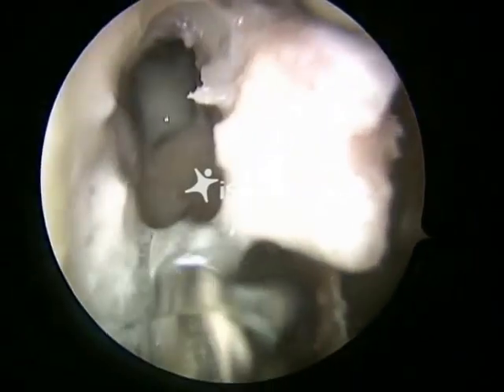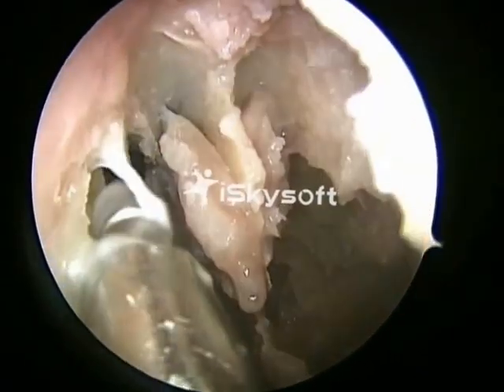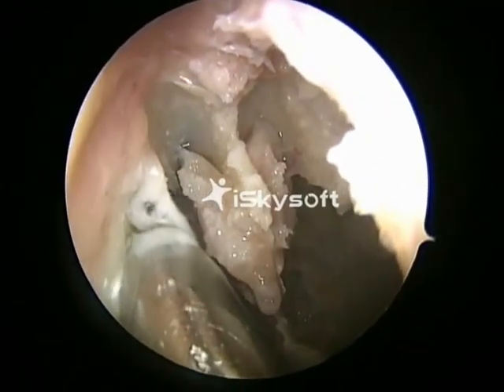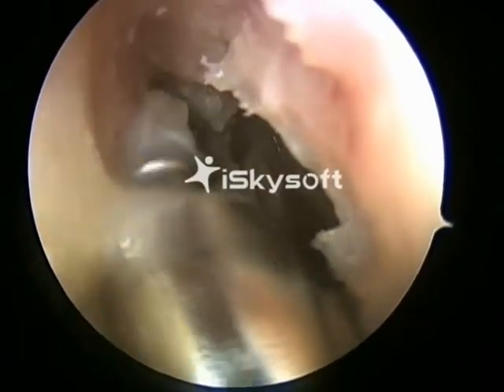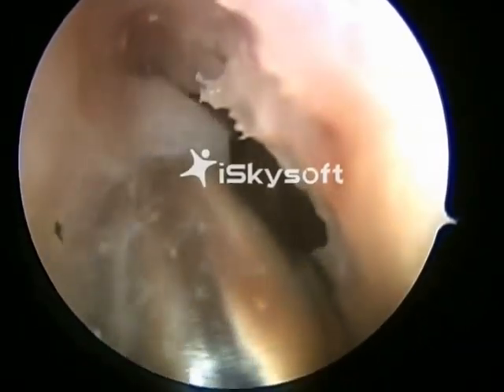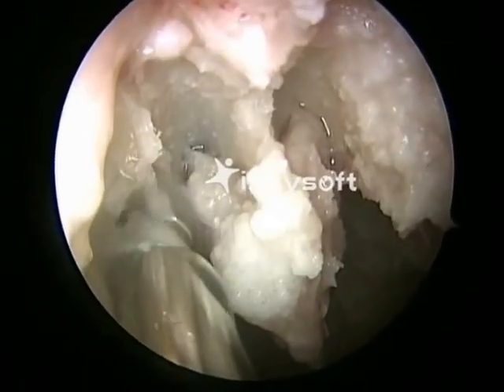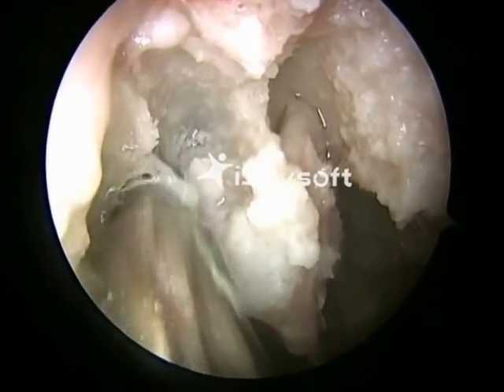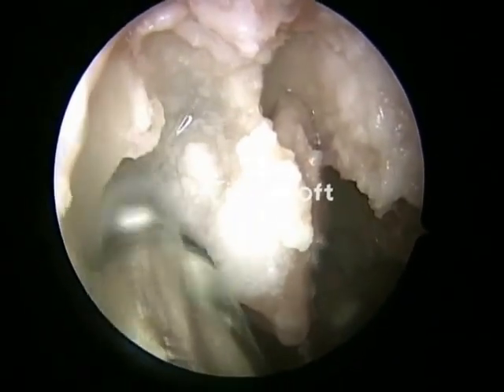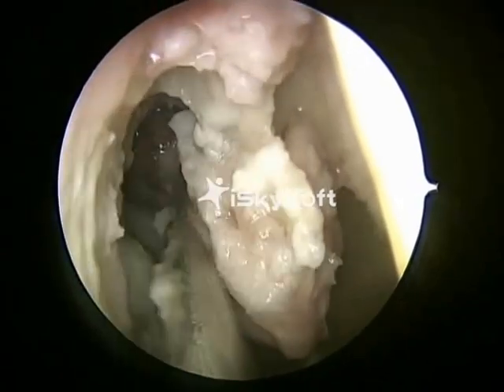The advantage of this burr is that we have an irrigation channel in it as well. And now you can see that we are drilling anteriorly and laterally only and never going medially. Now you can see the frontal sinus very well. That's the posterior wall of the frontal sinus, very clearly seen in your picture.